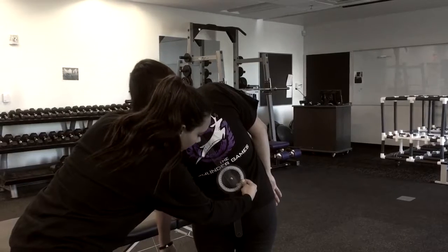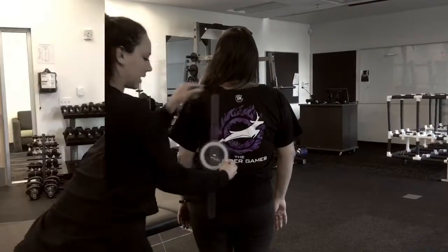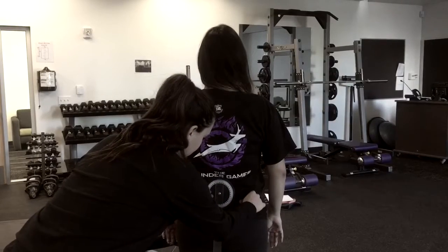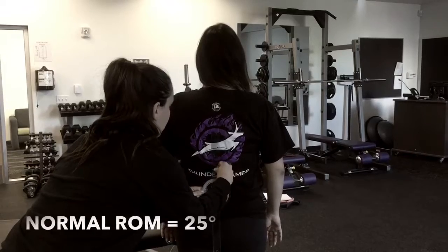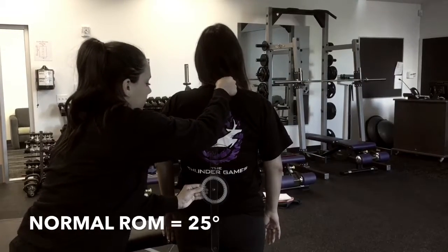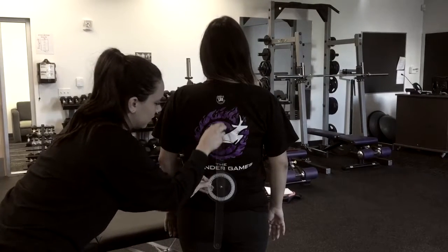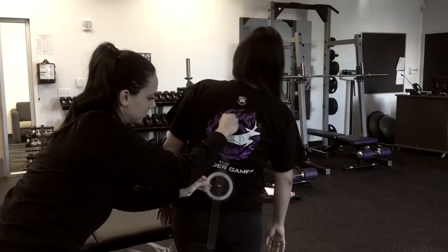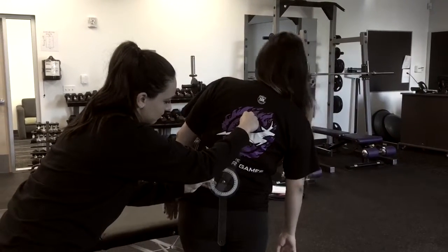moving medially. The stationary arm is perpendicular to the ground, and the mobile arm is aligned with the spinous process of C7. Normal range of motion is 25 degrees thoracolumbar side bending. Specifically shown in this video, the client receives 26 degrees side bending to the left and 28 degrees side bending to the right.